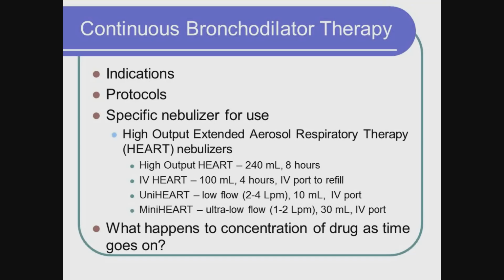Okay. Now, what is used in a lot of places is continuous therapy. We're going to use it whenever we want to have a bronchodilator that's going to be administered over a longer period of time. Instead of just delivering a treatment that lasts 10 or 15 minutes in duration, I'm going to do this over 3-4 hours. Meaning the standard nebulizer is not going to work out very well. You have to have a specific nebulizer that is utilized.